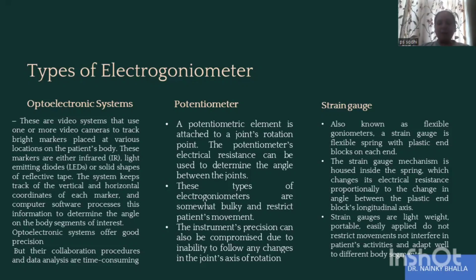So this is very lightweight, easy to move along with the patient's body, and easy to adapt to the patient's body segment. So nowadays we are using flexible goniometers along with the optoelectronic systems.